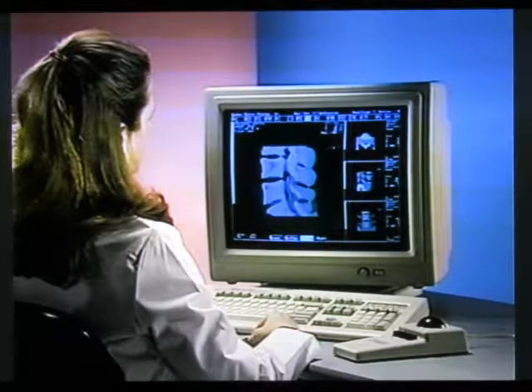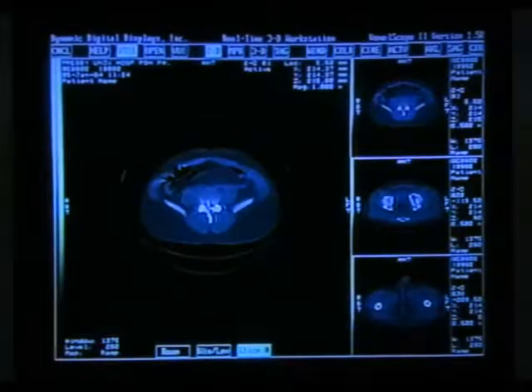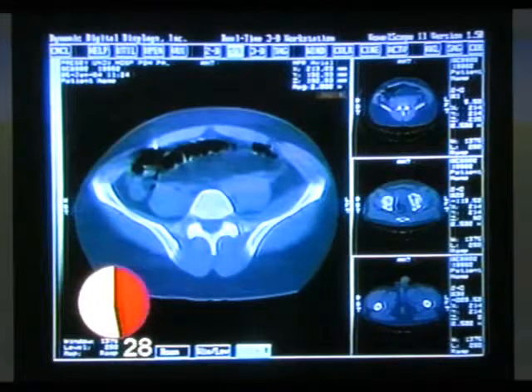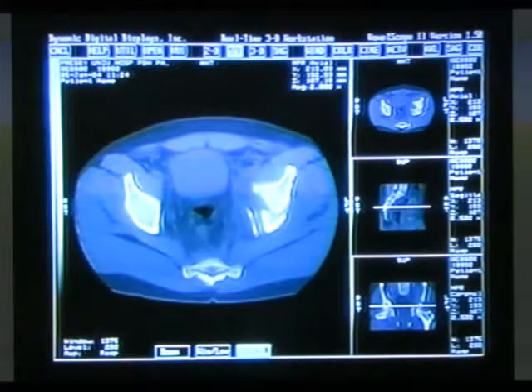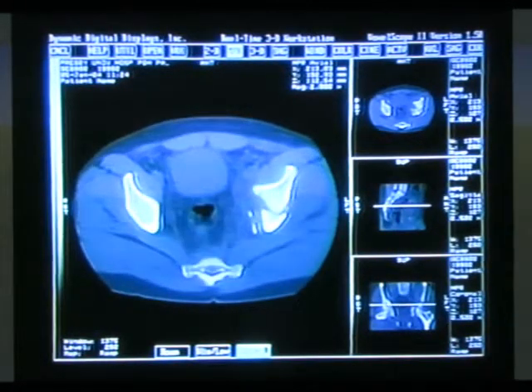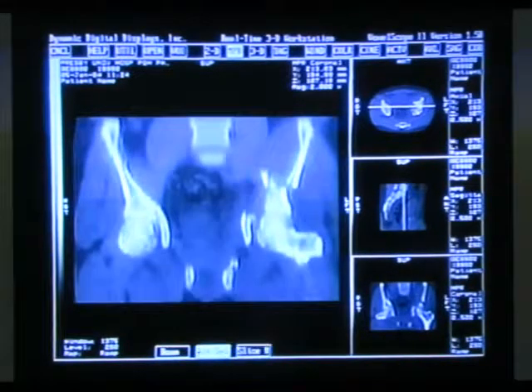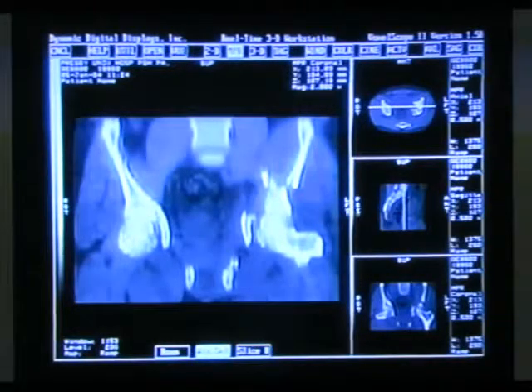Our next study will demonstrate even more of the Voxelscope's powerful features. This particular study is a 38-slice CT dataset of a multiple fracture of the left hip joint. Loading time for this case was 28 seconds. Scrolling through the slices provides a rapid overview of the case prior to detailed evaluation. Coronal images are especially helpful in this study for comparing normal right and abnormal left anatomy. The window and level can be adjusted to provide the full range of contrast as available on a CT scanner.